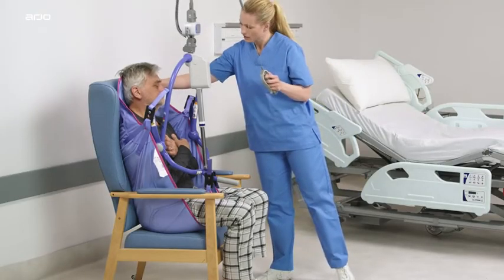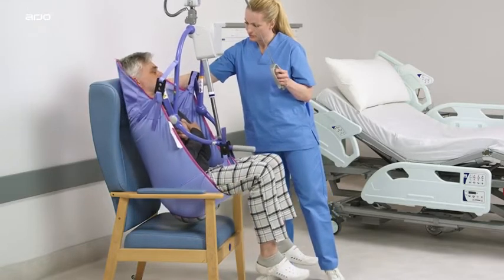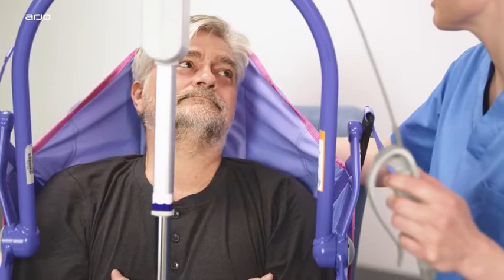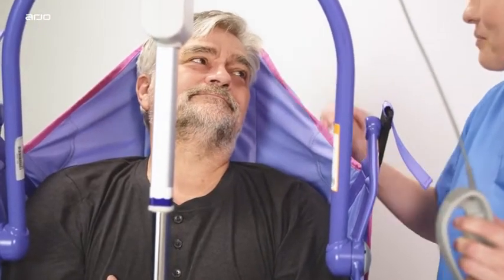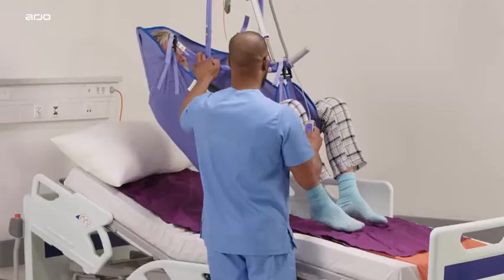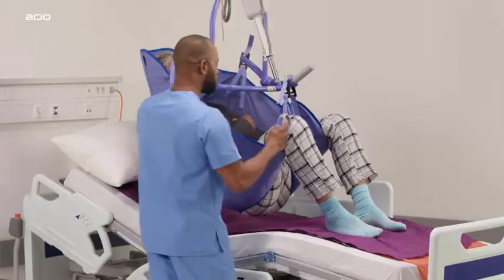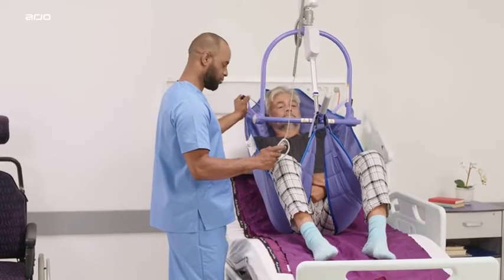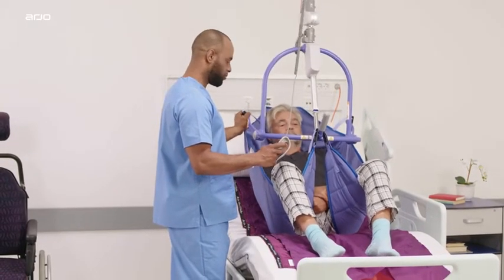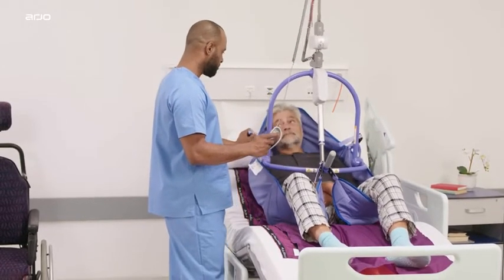Lift the patient using the handset control and adjust to a comfortable position for transfer. Slide the ceiling lift away from the chair. The angle of recline can be adjusted for more comfort. When lowering the patient back down, use the handset to put the patient into a position that aligns with their destination. This minimizes lifting strain for the caregiver and ensures comfort for the patient or resident.